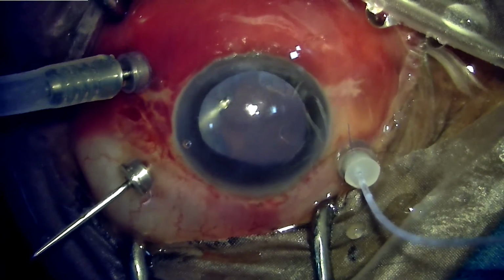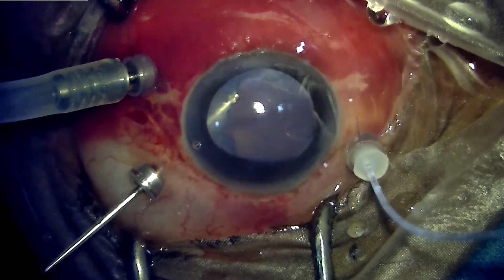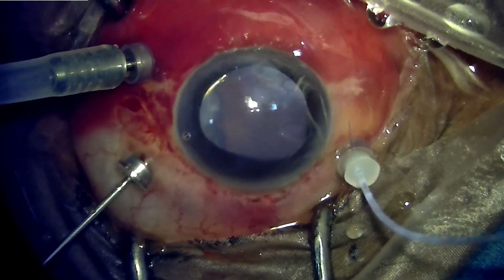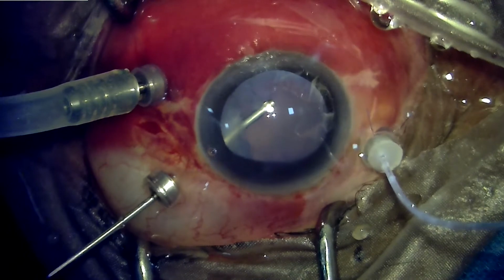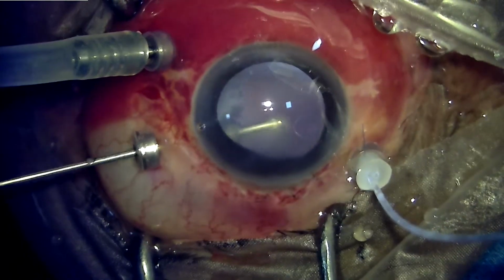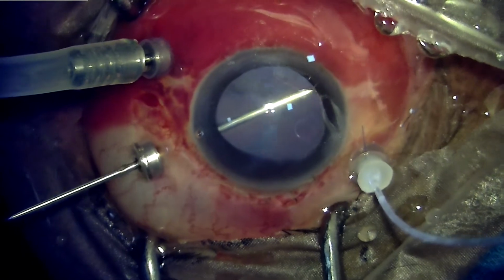And now we can see that we are clearing the remaining cortex, and this is an important step because in vitrectomy view is everything. So clear view is needed before we proceed further. The purpose is to find if there is any dropped nucleus or nucleus remnant in the vitreous cavity and excise it and remove it and then plan to implant an IOL.